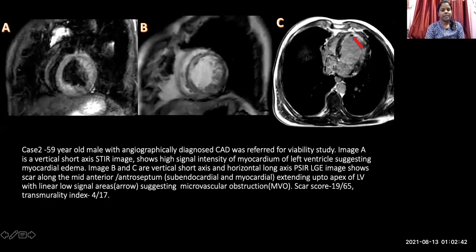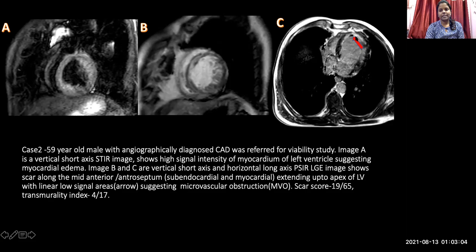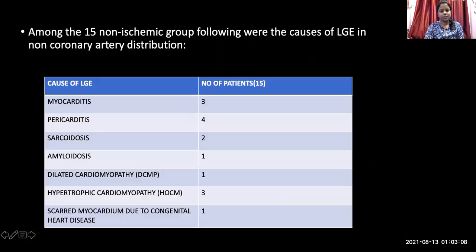The second case is a 59-year-old male with angiographically diagnosed coronary artery disease who was referred for a viability study. Image A is the vertical short axis STIR image showing myocardial edema. The B and C images are the post-contrast gadolinium-enhanced images showing sub-endocardial to mid-myocardial scar extending up to the apex, with a low-signal area in the left ventricular wall suggesting microvascular obstruction.